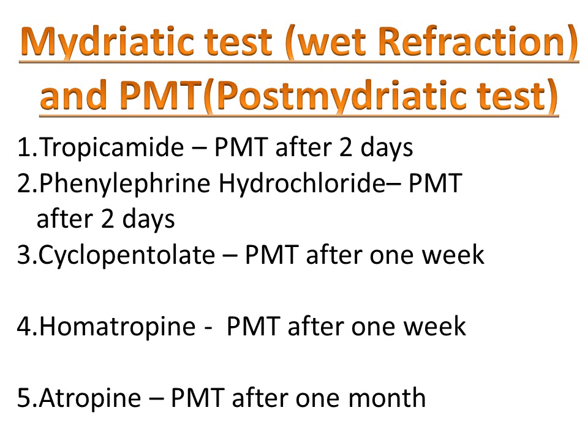What you did earlier is the mydriatic test: by applying a mydriatic and cycloplegic you have done wet refraction, or the mydriatic test, and we are supposed to do what is known as the post mydriatic test. On the day when we apply drops, we only do retinoscopy and send the patient away and ask the patient to come on a particular day depending upon which eye drop you have used, and the day when you call the patient for further examination is known as the post mydriatic test day.